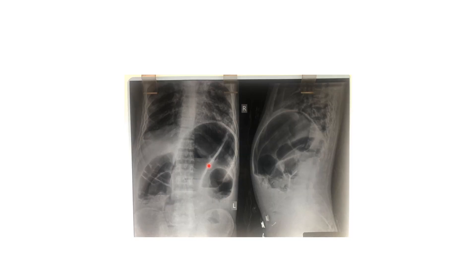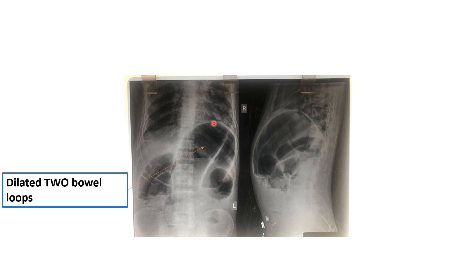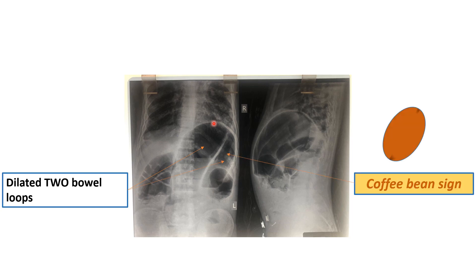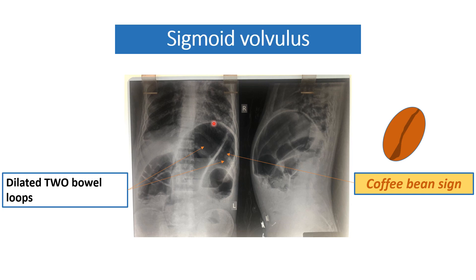This is a very classical X-ray. In this X-ray, you can see two dilated bowel loops with no haustra visible. These dilated loops are of sigmoid volvulus. Whenever there is such an abnormal radiological finding, we label it as the coffee bean sign, and it is characteristically seen in sigmoid volvulus.